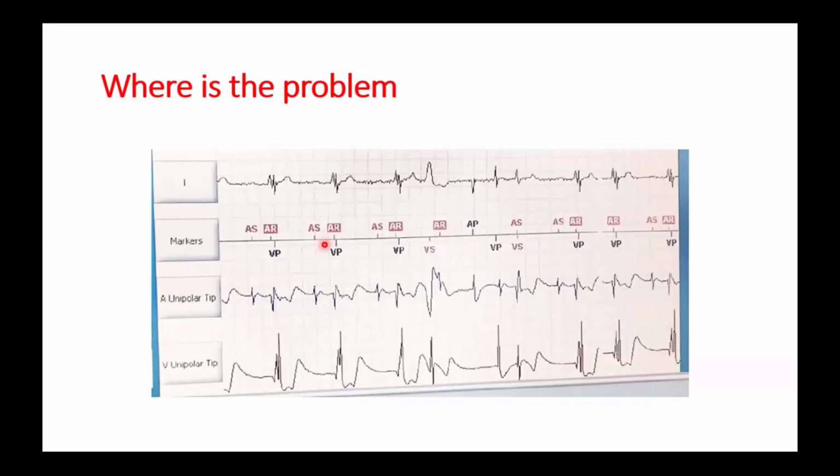Don't tell the patient you need to change the leads, you need to change the battery. No. If you can solve any problem with programming, it is better than opening a patient, causing infection, not being able to take the lead out, or inserting more leads, doing more problems and going to complications.